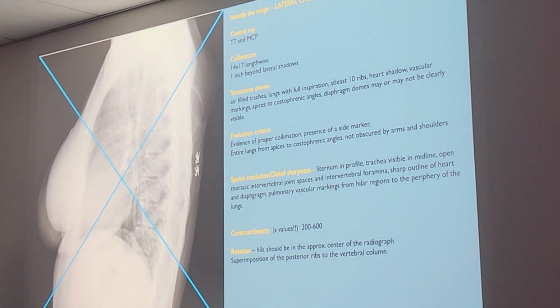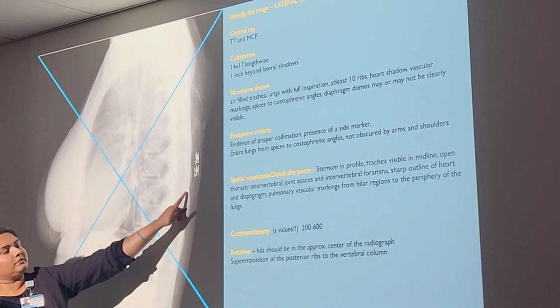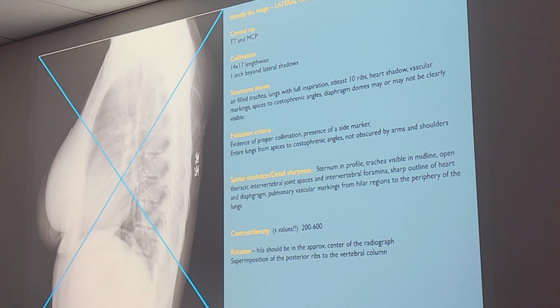Where are the two pictures seen? The one in the front and the back? See this set of ribs and this set of ribs, there should not be that much of a gap. I see. Alright, y'all getting it, kind of?